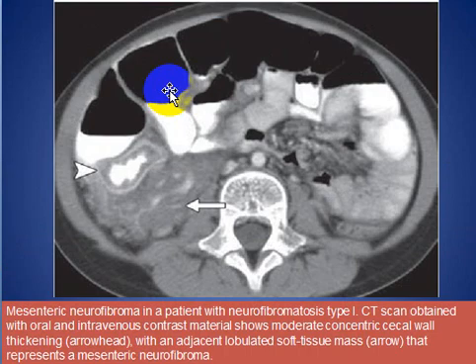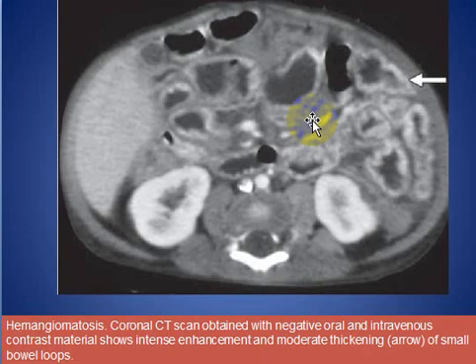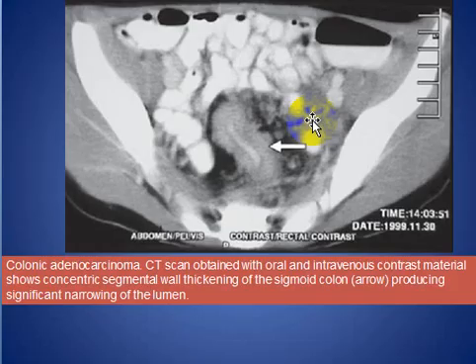Here is another patient with mesenteric neurofibroma. And here is a patient with a CT scan after oral and IV contrast due to hemangiomatosis.